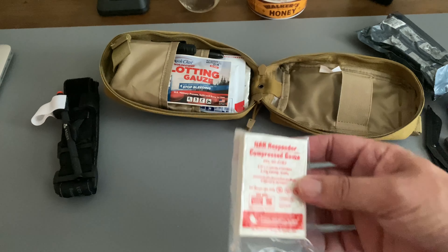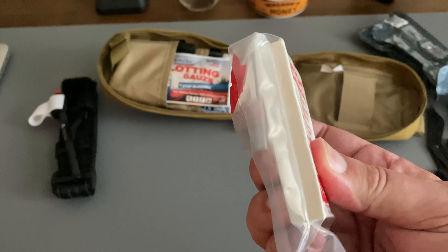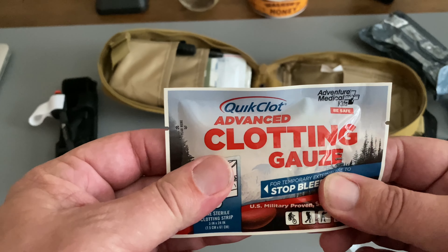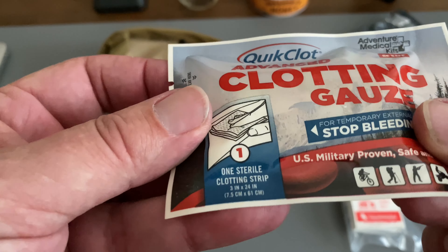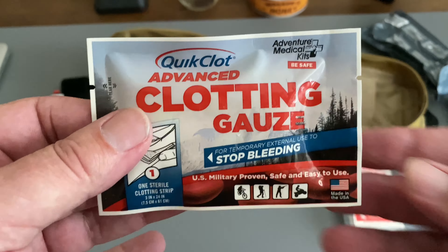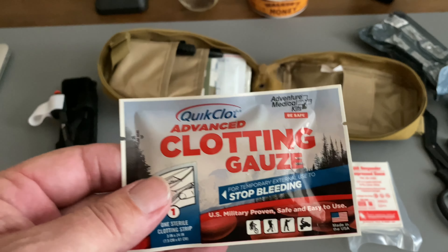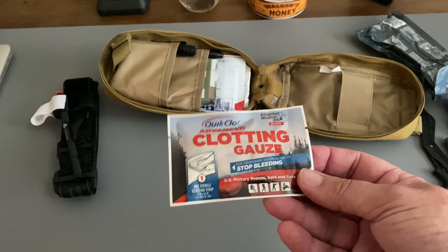We have some compressed gauze from North American Rescue — a nice little stack there. I also got some clotting gauze from QuickClot. It's a small amount, 3 inches by 24 inches. I'm thinking about getting something better, but I was trying to keep the cost down a little bit on this bag. It will do — it's pretty good stuff, pretty thick.